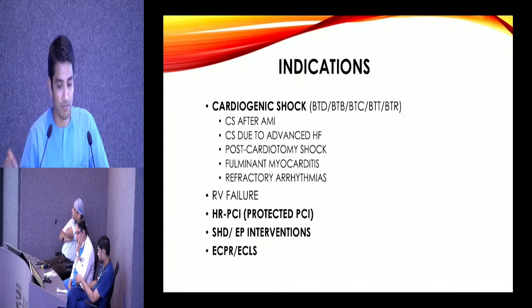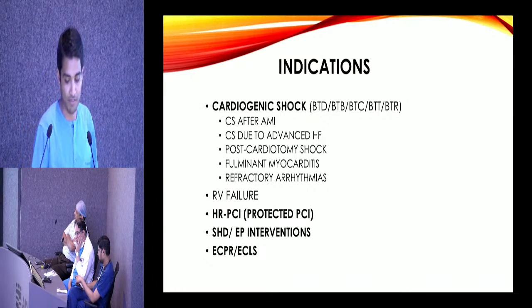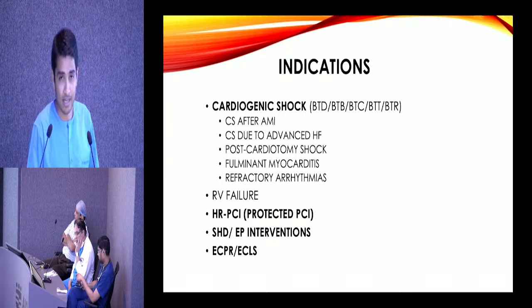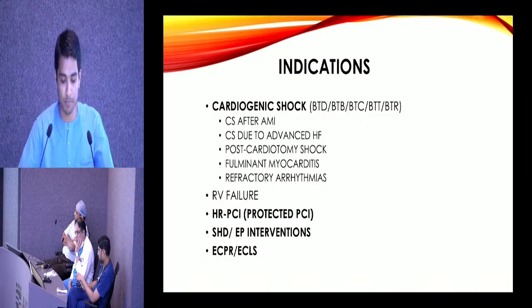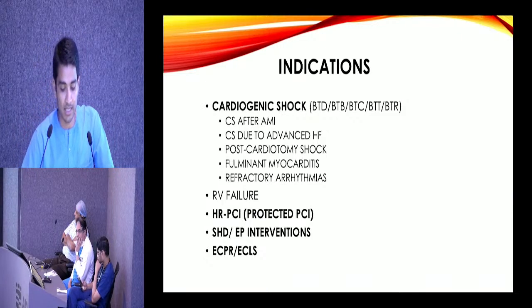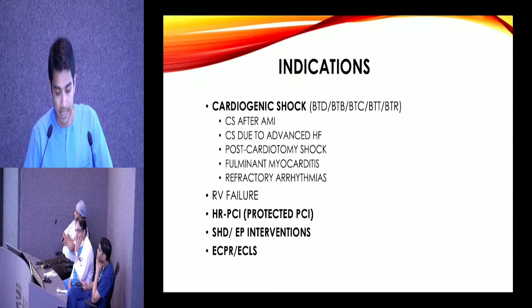Some other causes for MCS, rarer, are post-cardiotomy, fulminant myocarditis, and refractory arrhythmias. RV failure, like I said, we're not going to discuss much. And then these devices are also being used for high-risk protected PCI, structural heart disease, and EP interventions, and in the setting of cardiac arrest.